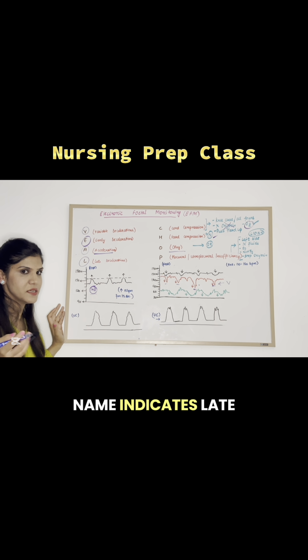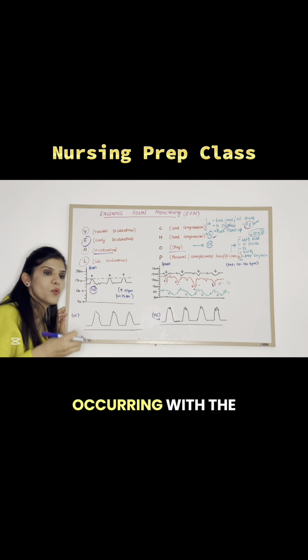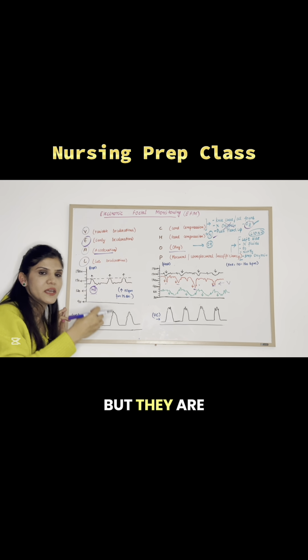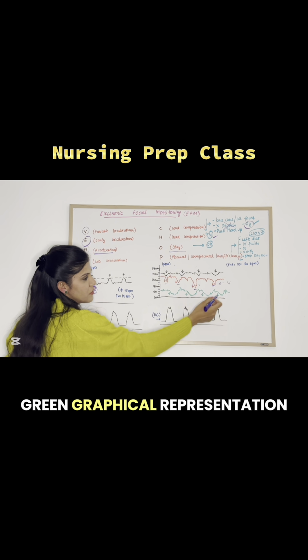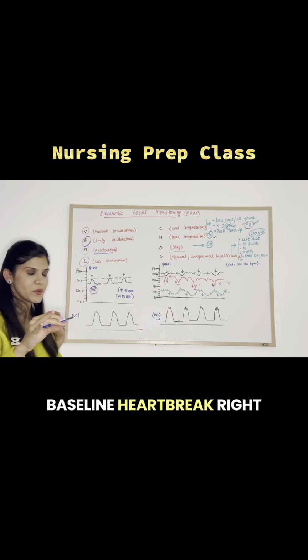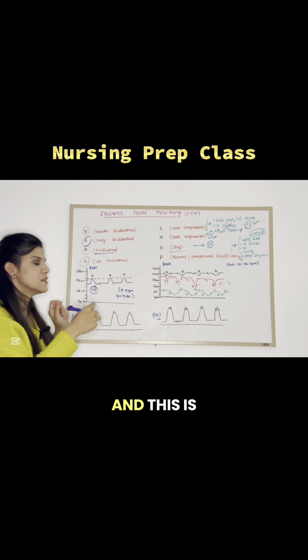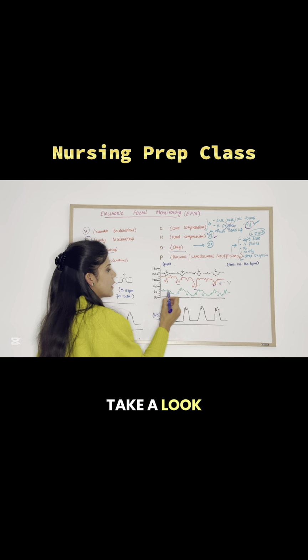So like the name indicates, late, they are late. Decels should have been occurring with the uterine contraction, but they are occurring late. So take a look at this green graphical representation. If we take a look here, forget about the baseline heart rate right here. I know this is way too less, and this is just a representation to make you understand. So right here, take a look at the baseline.